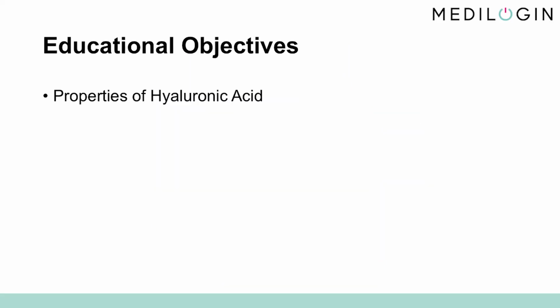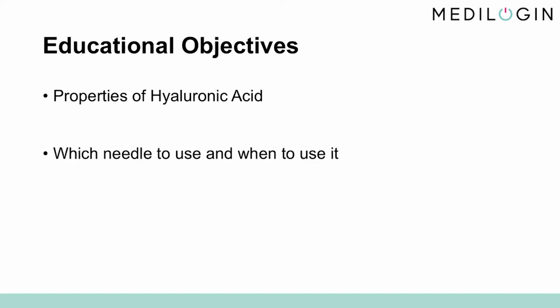In this lesson, we'll show you the variety of hyaluronic acid preparations and their properties, as well as the features of different kinds of needles. We'll discuss the differences between bevel types and when each type comes into use.